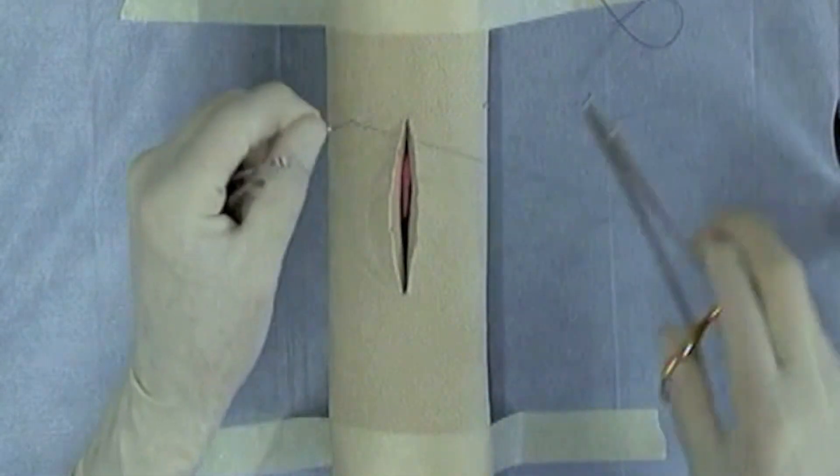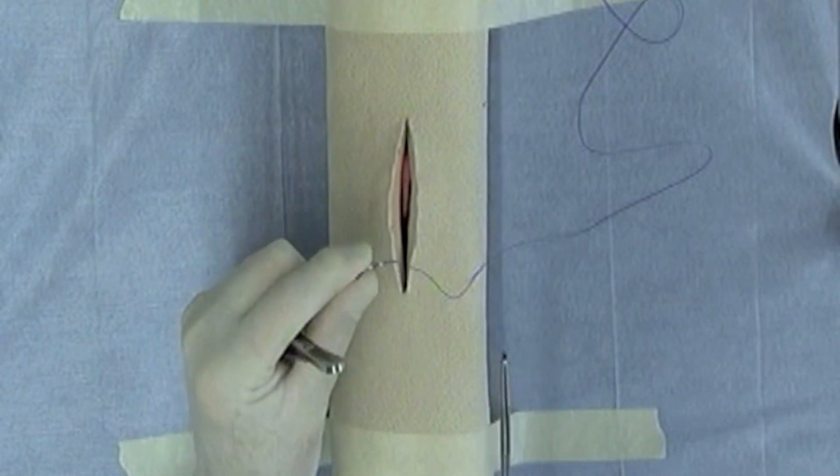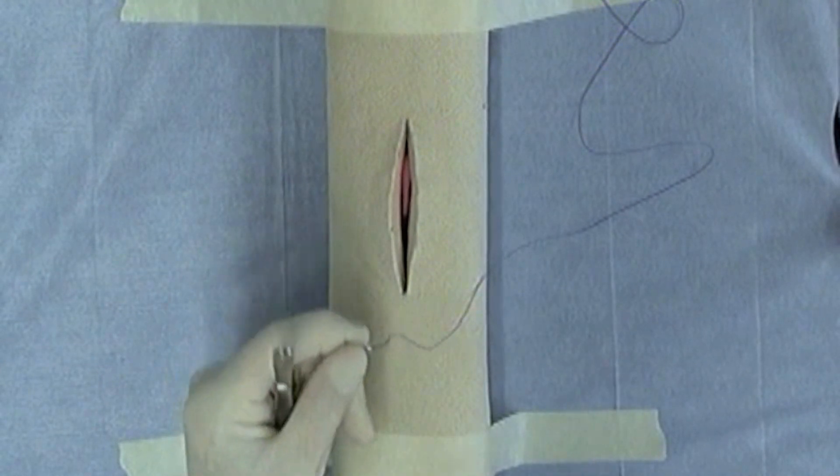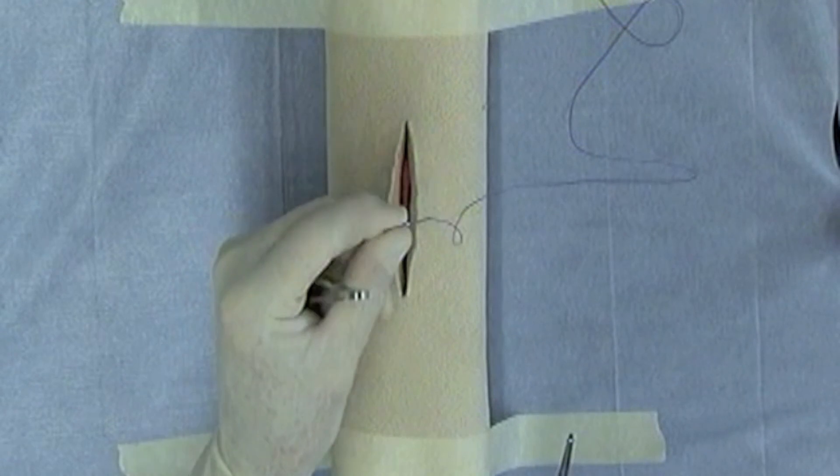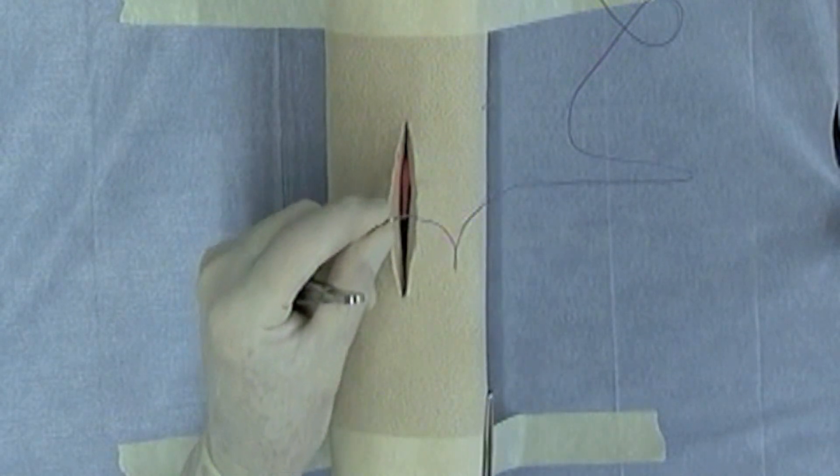To perform most of the suture patterns that you'll be required to do for this course, we're going to be using principally swagged on suture or a suture with a swagged on needle.